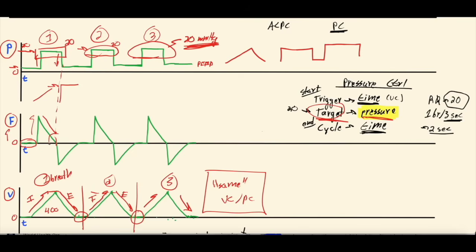So at this point, there's no more inspiratory pressure being given. So it drops down to negative flow because the patient starts to breathe out. So this here is inspiration. This here is expiration because the patient is breathing that air out. So there's negative flow. Inspiration, and then I'm blowing out, expiration. So there's negative flow up until the breath is over. And then there's 0 flow because there's no inspiration or expiration.